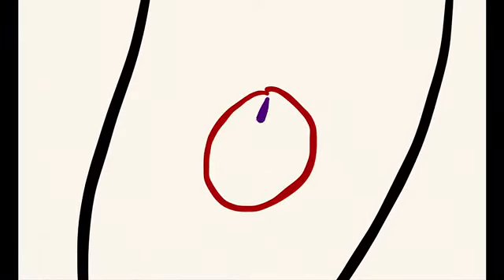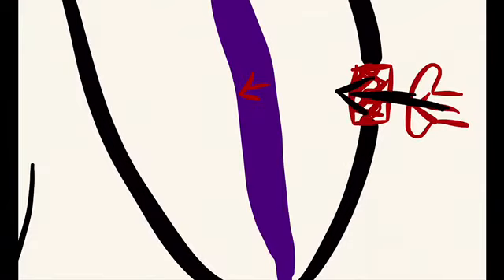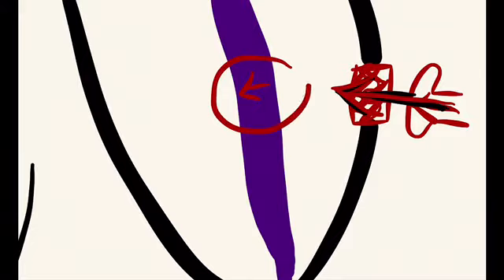Okay, by this window I am saying that there is the septum, and this septum is getting depolarized from left to right. So the vector of this depolarization is going away from me. Okay, I am sitting here, I am seeing from this side, and I can see that there is a vector going away from me. Okay, I am lead V6.